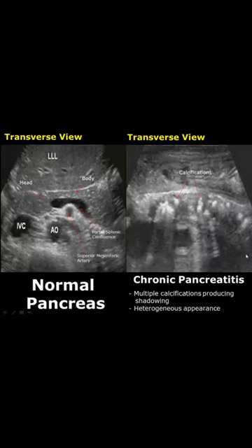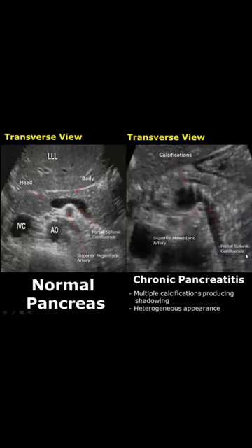Here is another image of chronic pancreatitis showing smaller calcifications and also showing some comet tail artifacts.